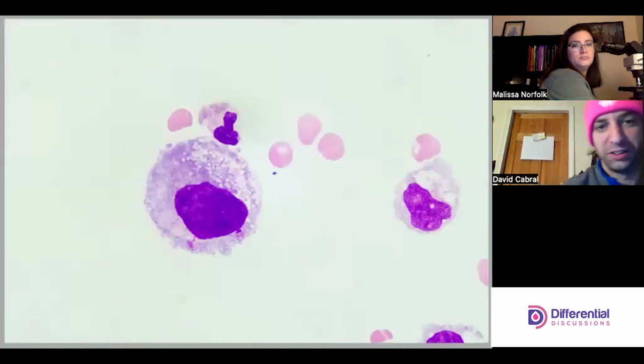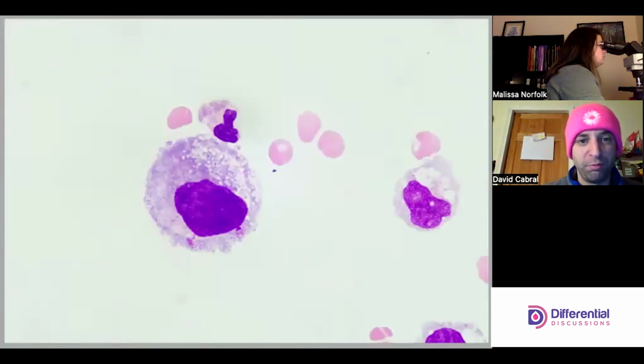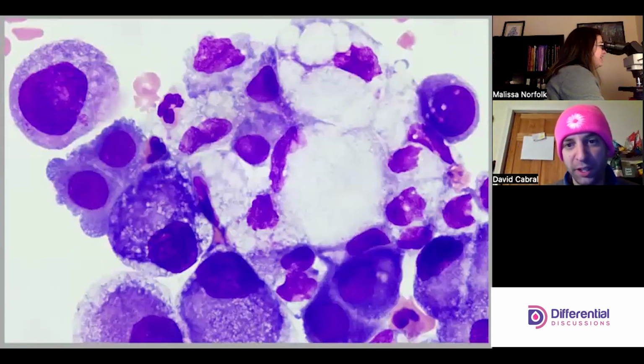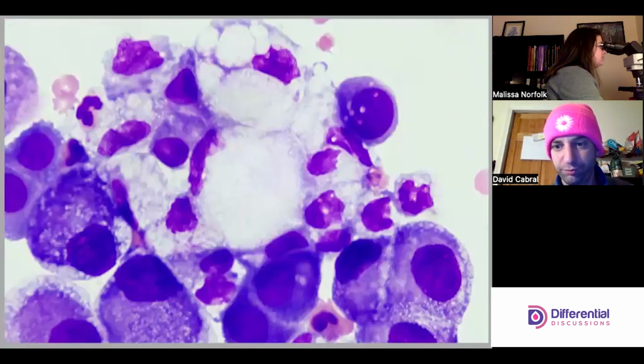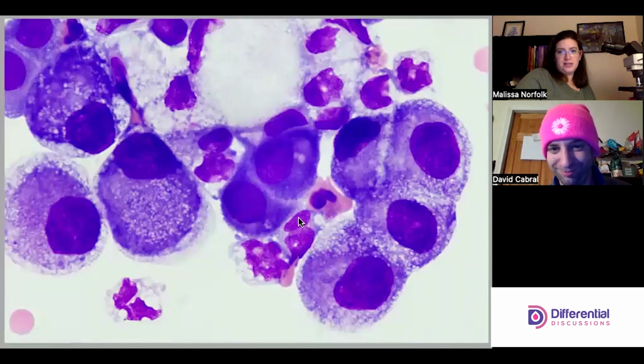Beautiful, beautiful cells. Lumpy, bumpy membranes. You can actually see some separation, a little bit of a window there. Those could be normal-ish mesos that are kind of compacted and squished.